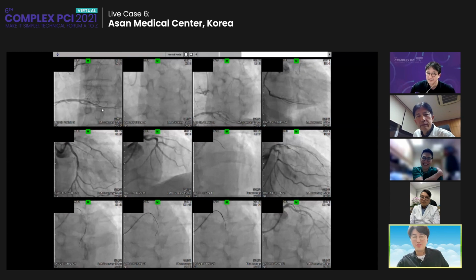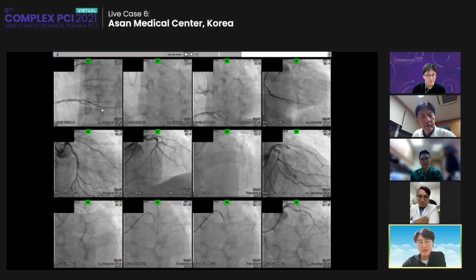Yeah, also in Korea, it depends on the individual hospital or physician. In my hospital, it is also not easy to undergo pre-CTO PCI CT angiography. In that situation, I must use my brain fully. But if possible, I also use the CT angiogram before CTO PCI. As mentioned, the recent randomized trial showed that CT angiogram-guided CTO PCI had a higher success rate, I believe.